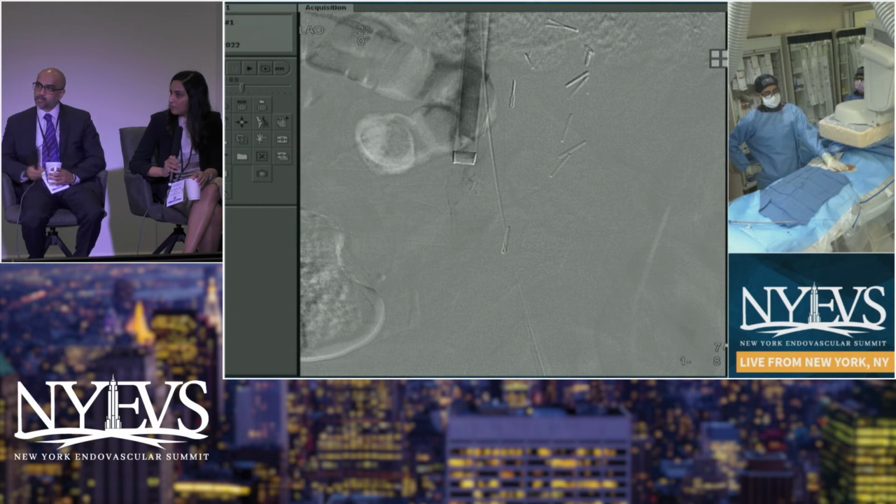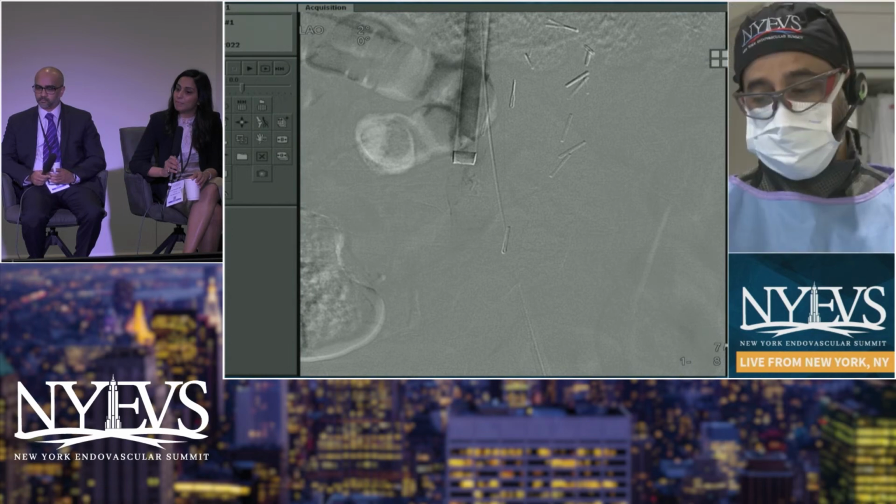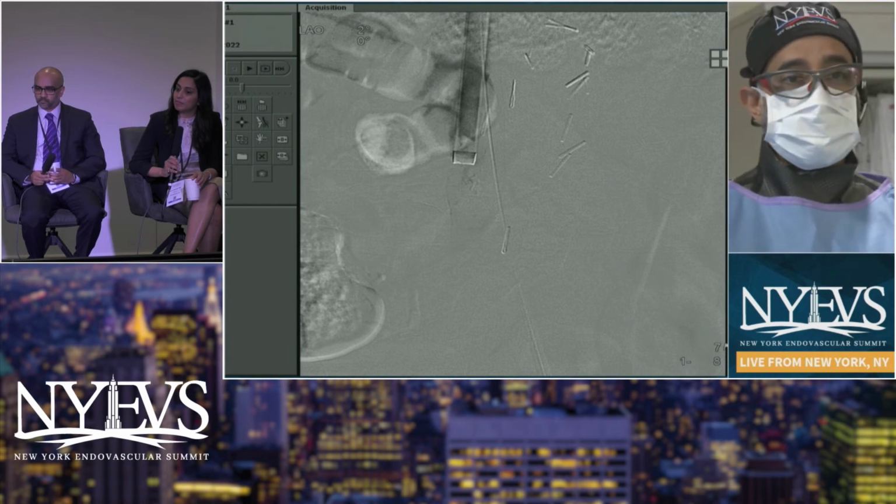Question from Brett. Yeah, Rahul, it's Brett Wickman. You mentioned before indications for this particular removal, and several years ago when a lot of this controversy developed, we were getting a lot of those requests: hey, I want my filter out. There were pretty soft indications for many of those, and we debated how we were going to go about handling that. It seems to be less, but can you touch on, for the panel or Rahul, when you take them out?